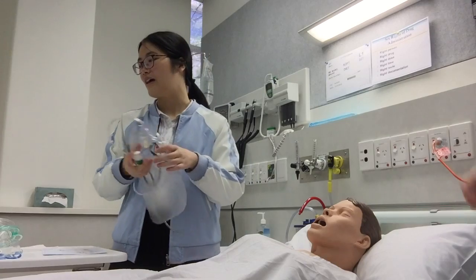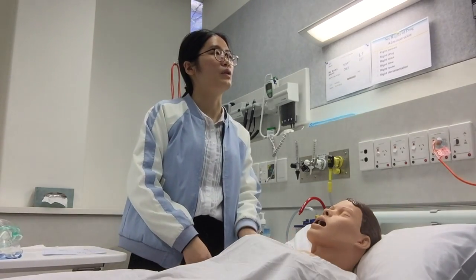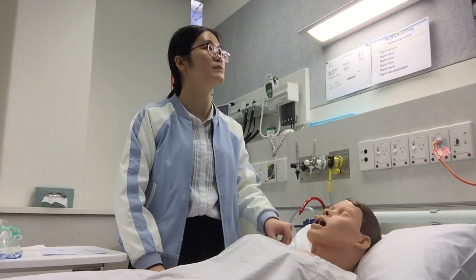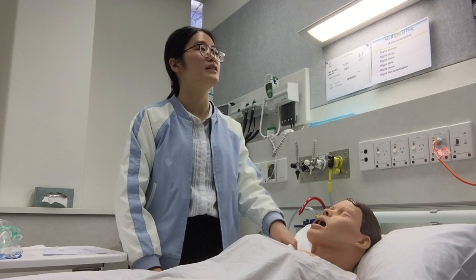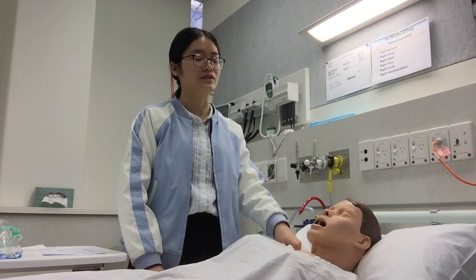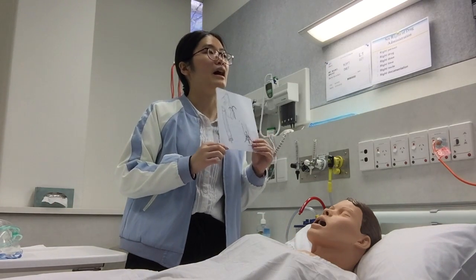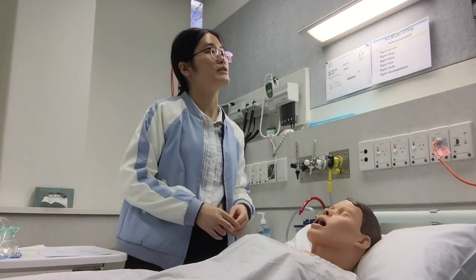Yeah. And another thing I want to ask is, do you know the differences between the high flow system and low flow system? Okay. Yeah. So you don't really know that? Can you tell me something about it? Yeah, so actually the venturi mask is a high flow system. And the other masks are low flow systems.